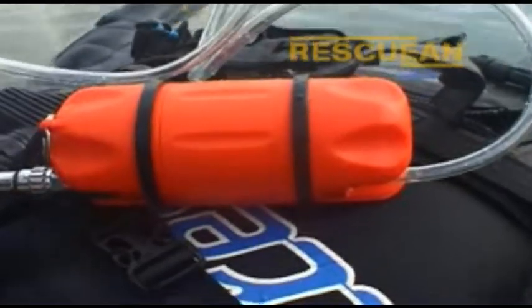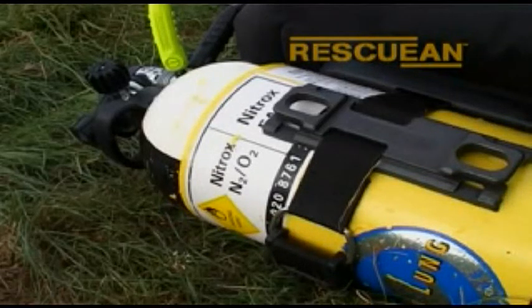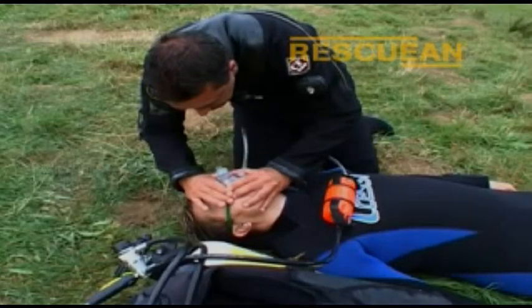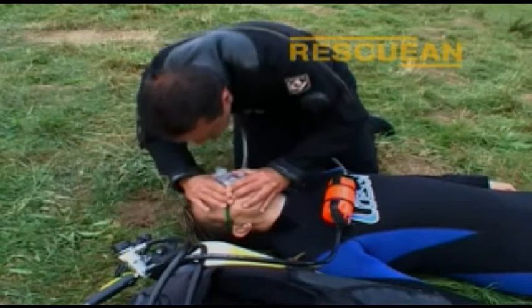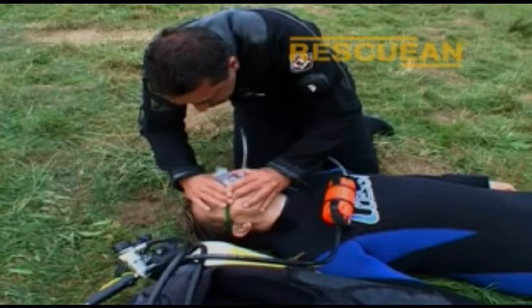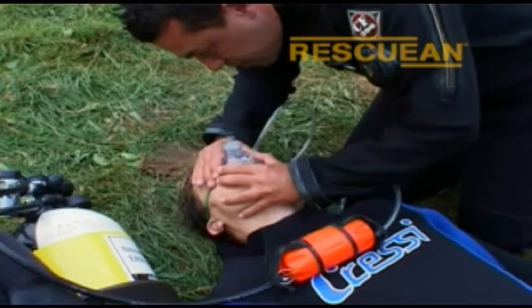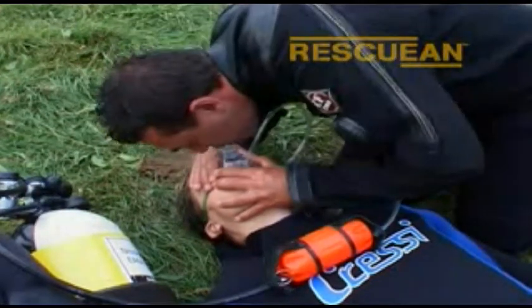The Rescue EAN pod allows a diver's nitrox to be given to both a responsive and a non-responsive patient in a constant, controlled flow of either 15 or 25 litres per minute. The concentration of constant-flowing O2 from the readily available nitrox cylinder, combined with mouth-to-mask rescue breaths, is of more benefit to the patient than just rescue breaths alone.